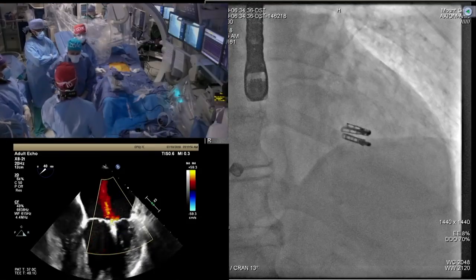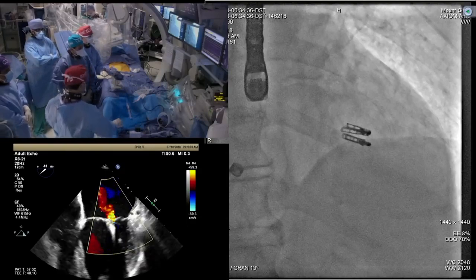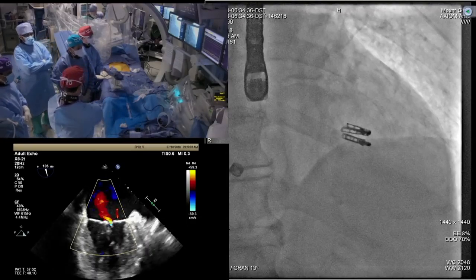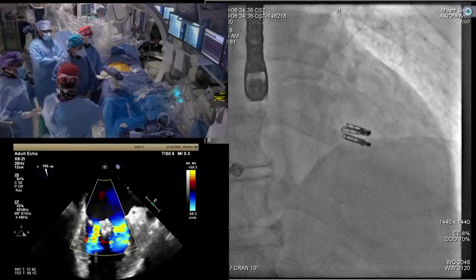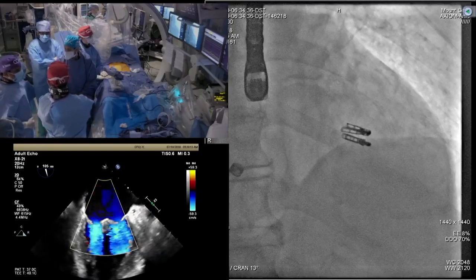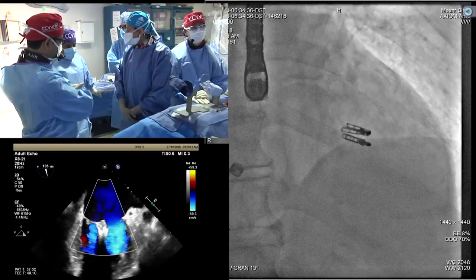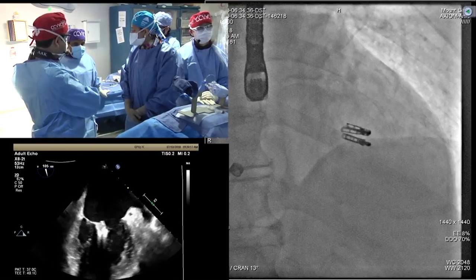We are done here. You can finish your slides. Yeah, beautiful. But this is definitely the threshold question. We have not systematically analyzed it, but last year, roughly, we saw about 18% of cases where we did a second clip, and only a handful of cases, 2 to 3%, where we did three clips.